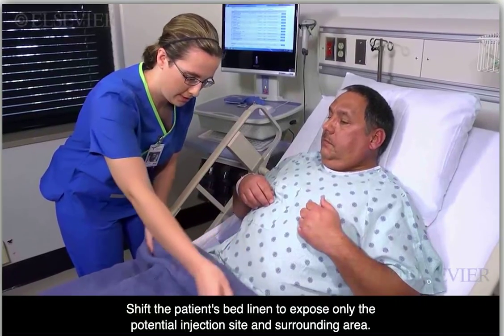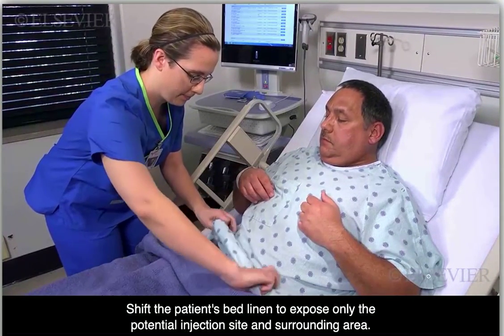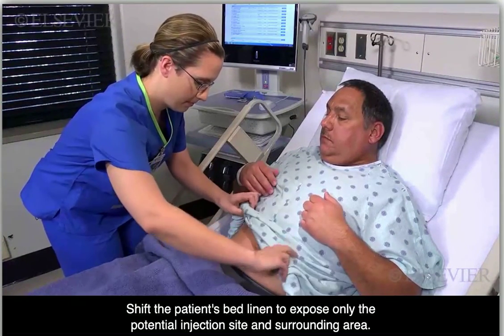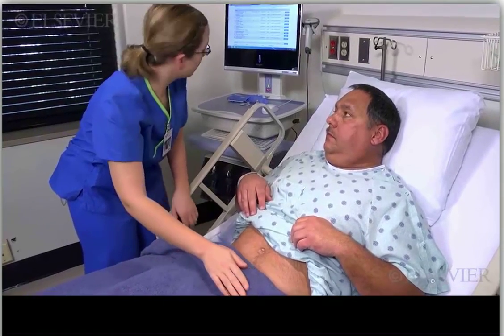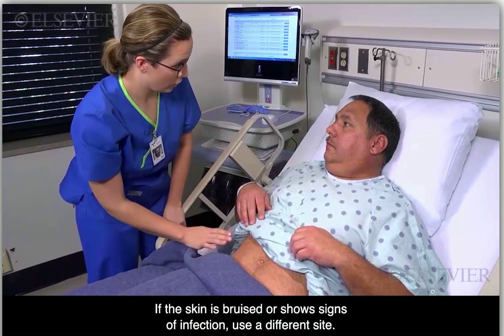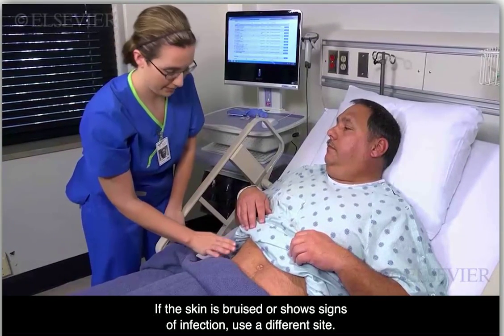Shift the patient's bed linen to expose only the potential injection site and surrounding area. Inspect the area for bruising, inflammation, and edema. If the skin is bruised or shows signs of infection, use a different site.